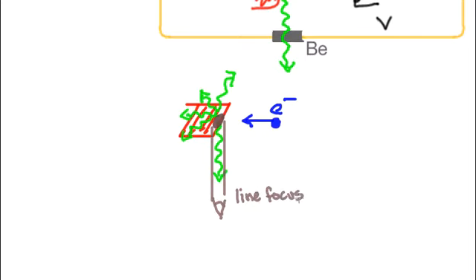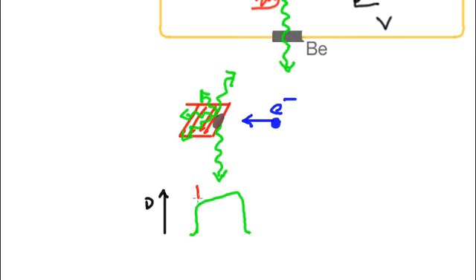You'll hear that phrase. And then third thing, there's a differential attenuation in the anode itself. That is, some photons are produced inside the anode material, and they have to travel through some material before they emerge. That causes some effect on the beam. So if I draw a profile of the dose or exposure, it's not exactly flat. There's a lower flux of photons on the left side of this image relative to the right because they're going through more material in the anode, and this is called the heel effect. And it depends on the angle of the anode as well.